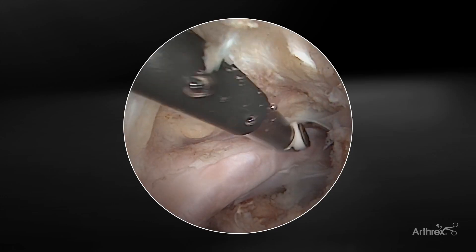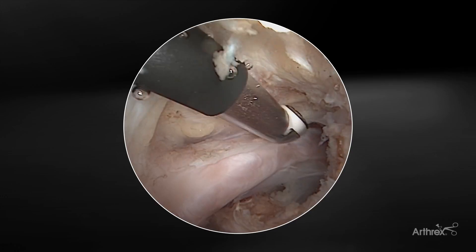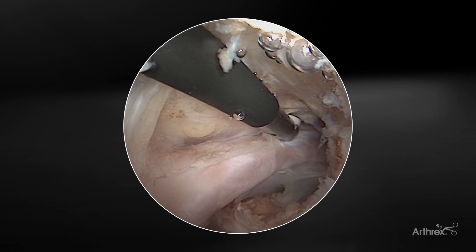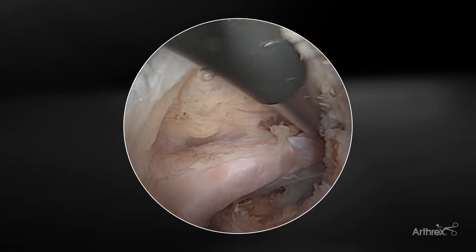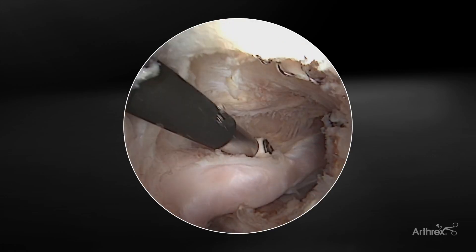Once again, due to that anatomy and the design of the tip of this device, it easily navigates those tissue planes, allowing for the facile release of some of those adhesions as we work medially. And you can see we have a nice open release of that interval, with complete excursion and mobilization of the subscapularis tendon.